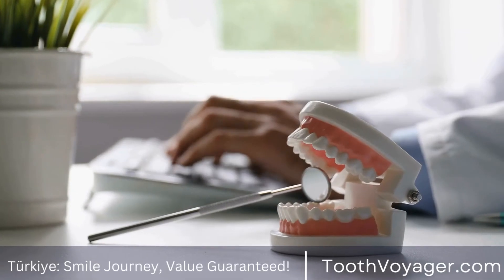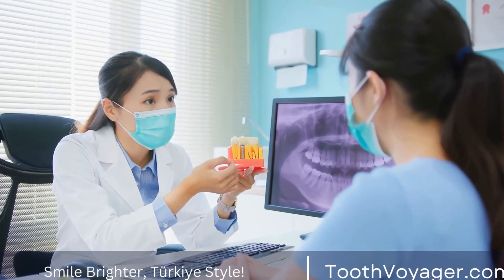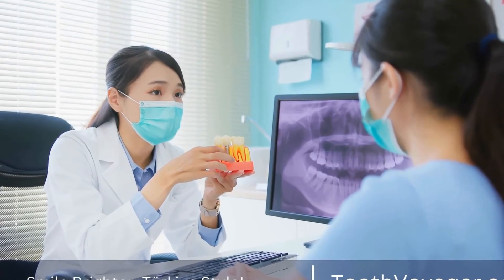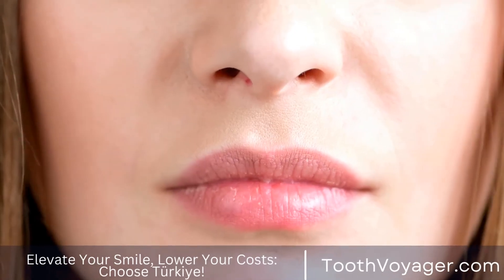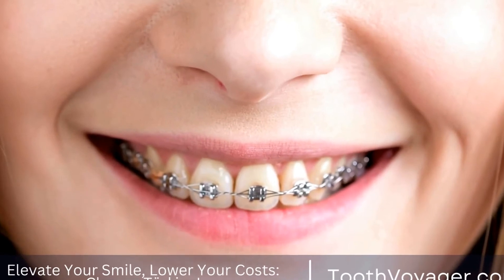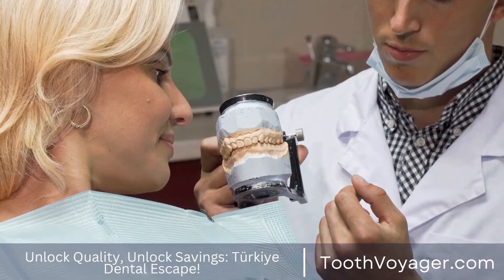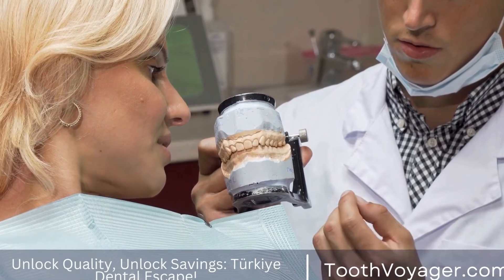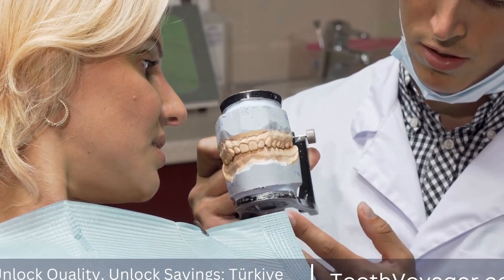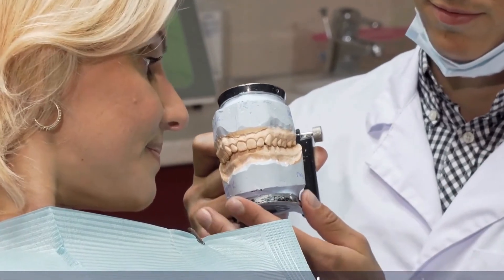Implant supported dentures combine the stability of dental implants with the convenience of traditional dentures. This innovative treatment involves placing dental implants in the jawbone to anchor a custom-made denture securely in place. Implant supported dentures can provide patients with improved speech, chewing ability, and confidence, as the denture will not shift or move during eating or speaking.